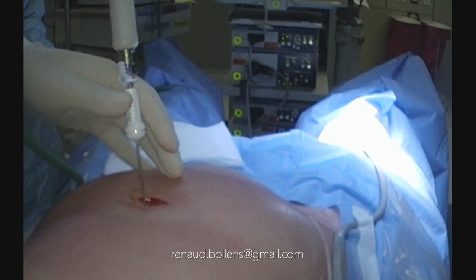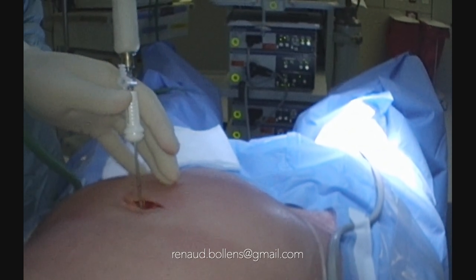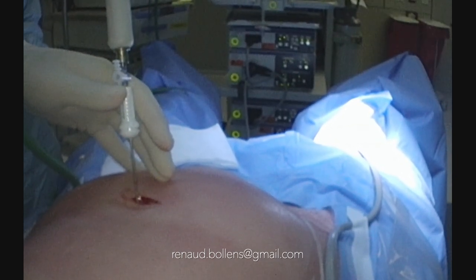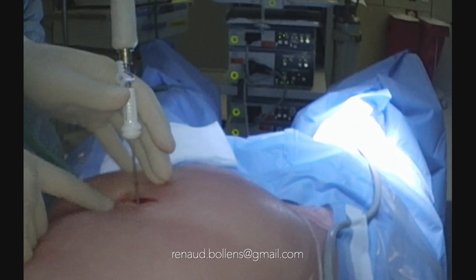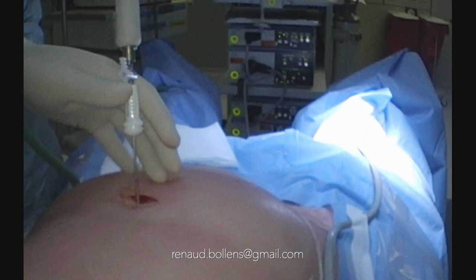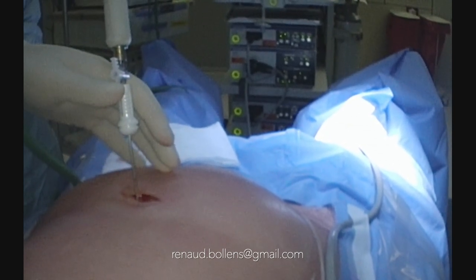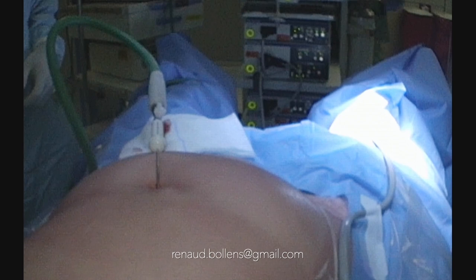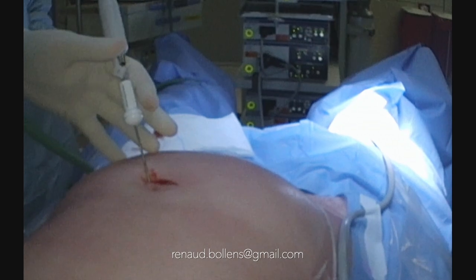The volume of the abdomen is not predictable because in a patient who had previous pregnancies, of course, it can be higher. In a young man with a strong abdomen, the volume can be low. Of course, if you have a low volume, we know that you also have a small space between the wall and the bowel. Then we must be more careful because we have more risk to touch the bowel when we put the first port. Okay, actually, I have a good pressure and the volume is 4 liters. If I have less than 2 liters, I know that the space is small. I must be careful. If I have more than 2.5, I know that it is a big volume and normally it is safe.